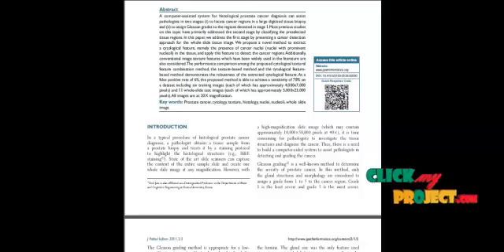The extracted features were then passed into the classifier. Here we are using a support vector machine for classification. The classifier classifies the images into normal or abnormal using the training features and testing features with the true labels that we are providing to it. Thus, we are identifying whether the input tissue sample is affected or not affected.